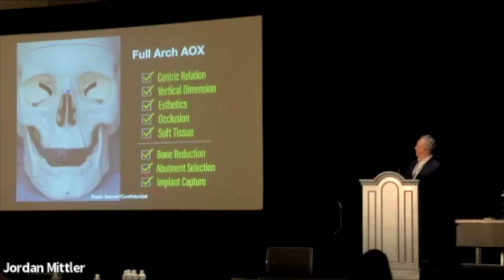So the point being is this implant capture becomes the key record, it becomes the enabling record. And photogrammetry is one of the 8 records. That's what I want to be clear. It's only one of 8. In and of itself, it's useless. But merged with other prosthetic data, it becomes very valuable. And now we can really enter into the digital world, and photogrammetry is opening that door.